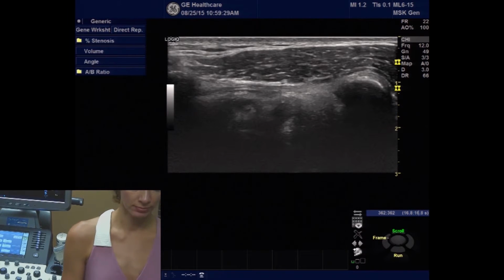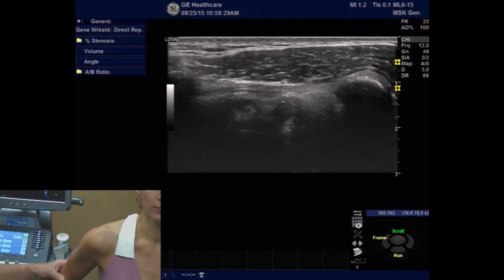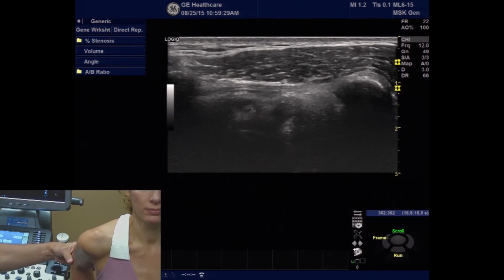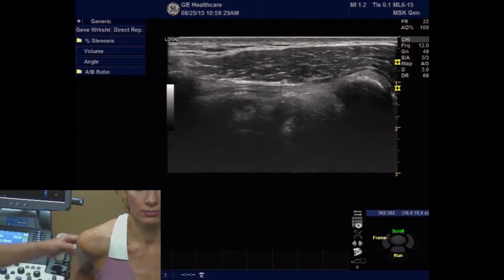After we've completed the supraspinatus evaluation in the crass position, we're going to put the patient's arm into the modified crass position and then once again do a long and short axis evaluation of the supraspinatus tendon. The modified crass position also gives us a very nice evaluation of the cuff interval. So I'm going to ask the patient to put their hand behind, as their hand is going in their back pocket. We're going to push the elbow in towards the spine.